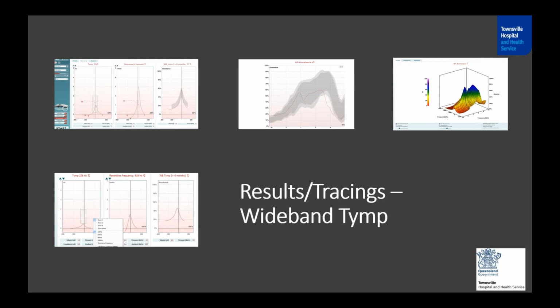Sreedevi, you talked of the normative data saying that till 5 years of age the normatives keep changing, and only by 7 years of age they are adult type. So if we have to have a normative range in children, what age range do we have? Should we have it for every month, 3 months, 3 years? What is your recommendation based on whatever studies you have done? When you look at the equipment, it has a built-in normative range, so you can select the age ranges in that. It gives you the 5th to 95th or 10th to 90th percentile. But if you want, you can develop your own normative data. But it's already built into the equipment as well.